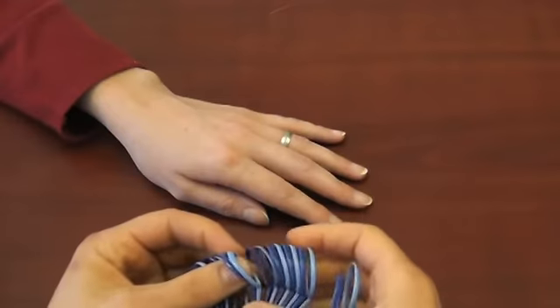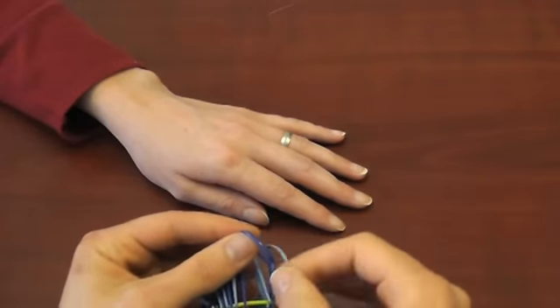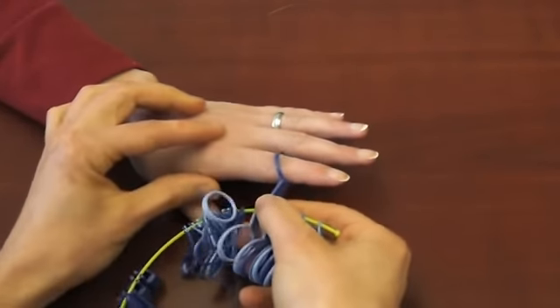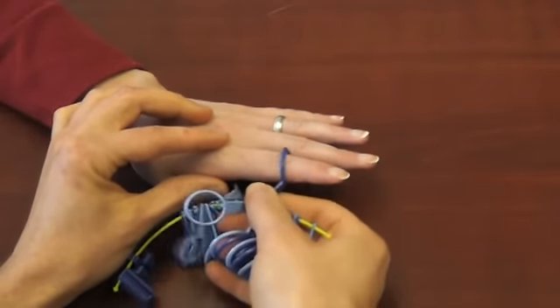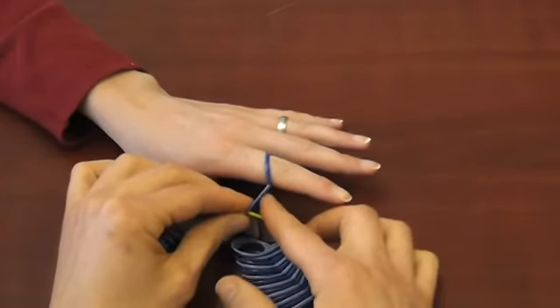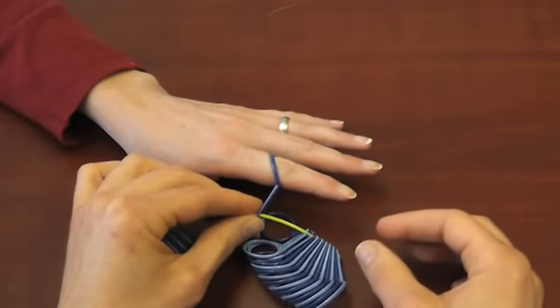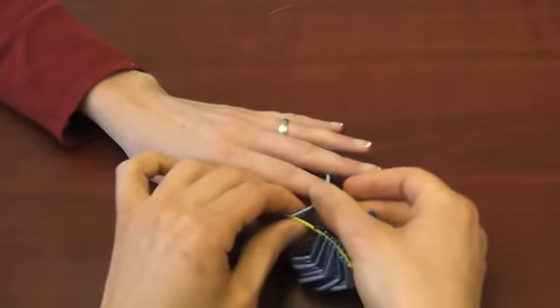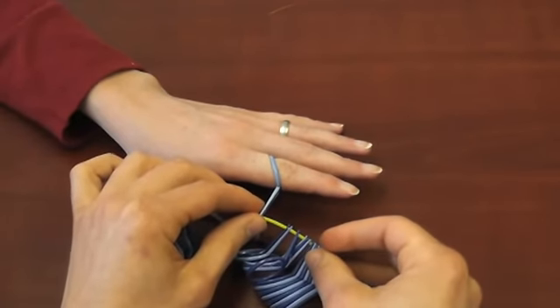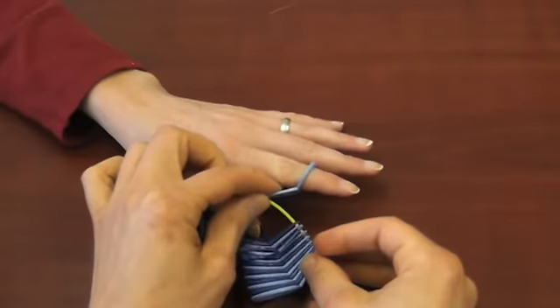Now that you understand the holder, let's find some sizes. To start out, find a proximal size that is snug sliding over the joint, and when angled, rests at about 15 or 30 degrees, depending on the finger. The tab will rest approximately 5 millimeters from the center of the joint. Go up or down in trying on sizes until you come to one that seems to fit well. Detach it from the cord and set it aside to use later in the holder.